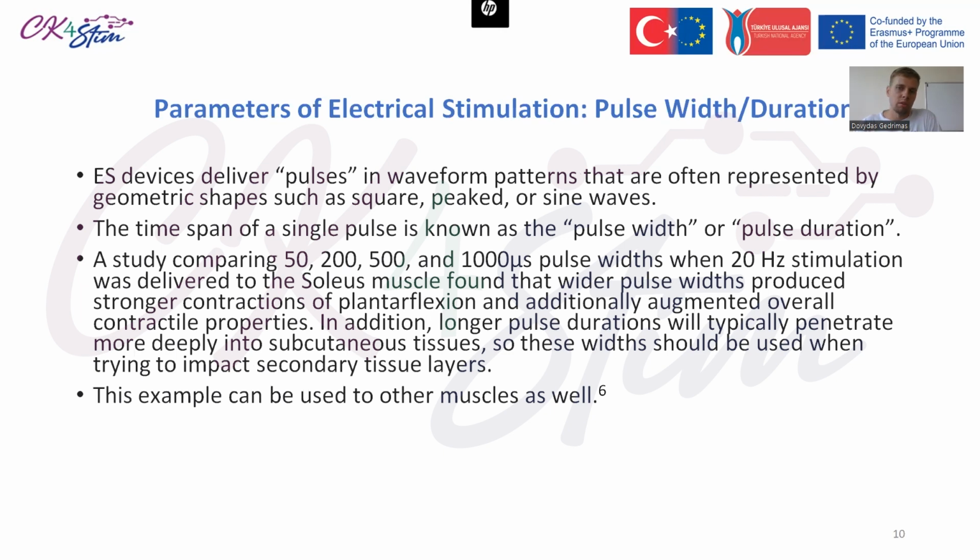Pulse width or pulse duration. Electrical stimulation devices deliver pulses in waveform patterns that are often represented by geometric shapes such as square, peak, or sine wave. The time span of a single pulse is known as the pulse width or pulse duration.